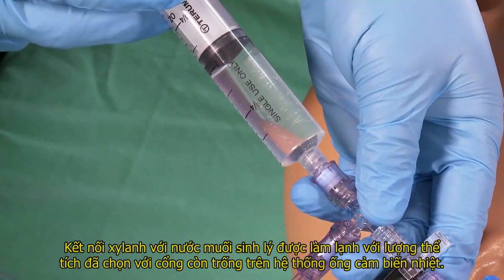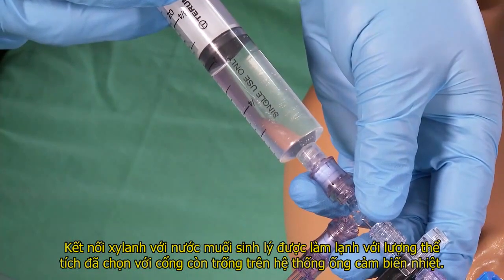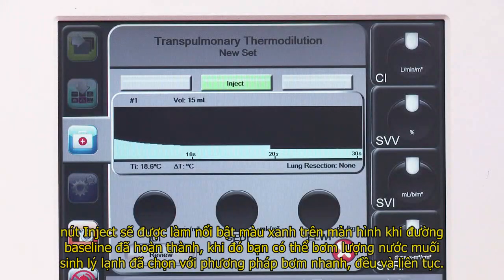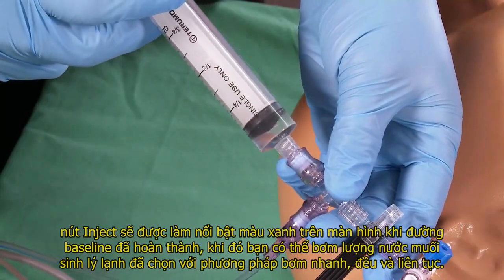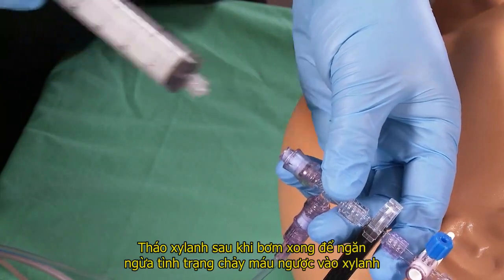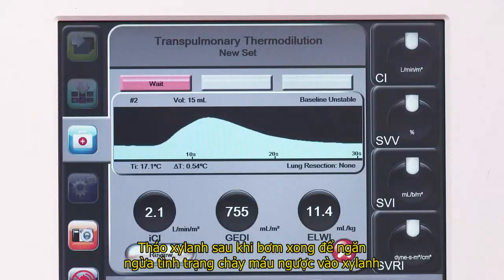Connect a pre-chilled syringe with normal saline and appropriate injectate volume to the free port on the thermistor manifold. The prompt to inject will appear on the screen when the thermal baseline is reached. Then you may inject the pre-selected amount of chilled normal saline using a rapid, smooth, continuous method. Remove the injectate syringe to prevent backbleeding into the syringe.